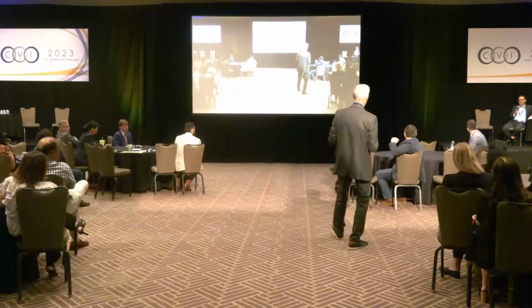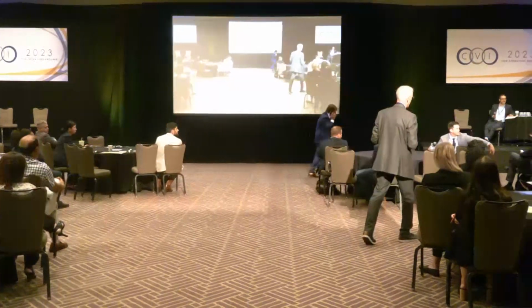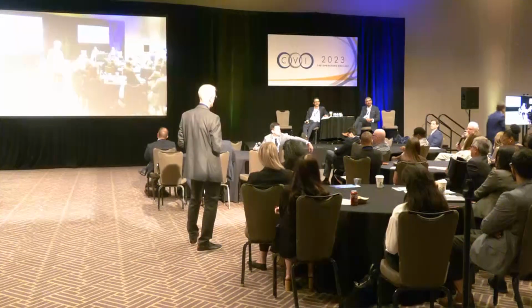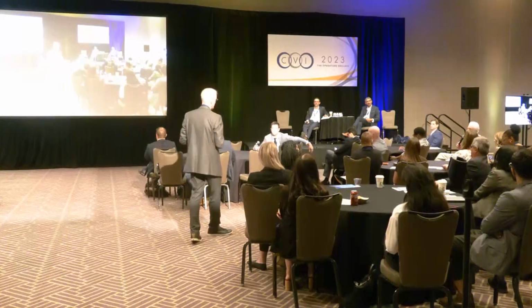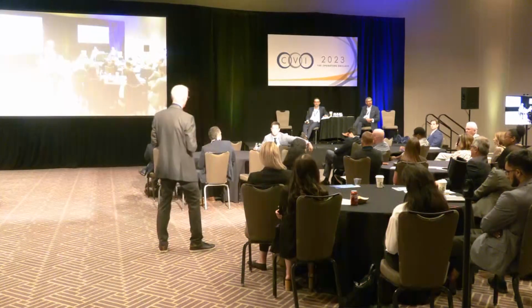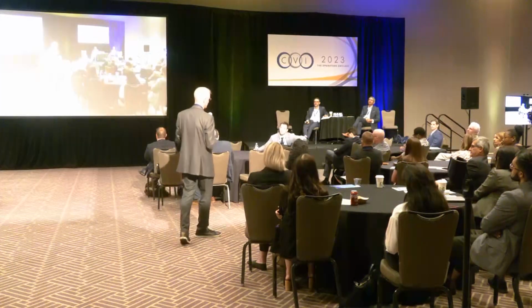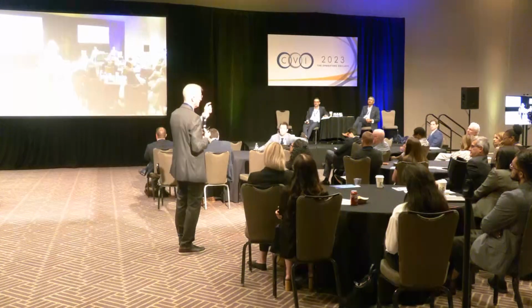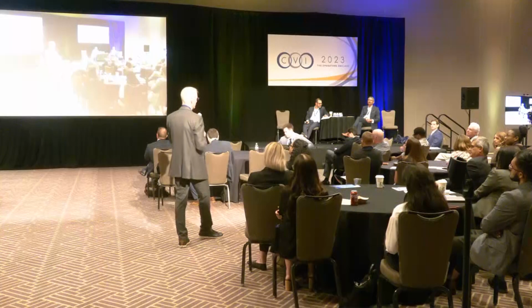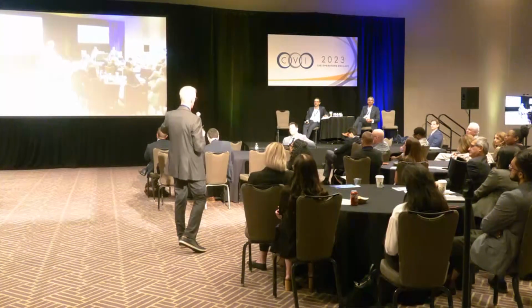John, one last question, because I think this is an important answer. Beyond the size, do you take anatomy into consideration, such as how long the infrarenal neck is? What do the landing zones look like, to shade you off of the absolute size consideration? Yeah, Gary, that's a really important point. If I had an aneurysm myself, and I've got good anatomy, meaning a long neck, and I don't have a bunch of calcium or thrombus, and I've got good iliac arteries, you can expect very good long-term results from EVAR within the IFU.